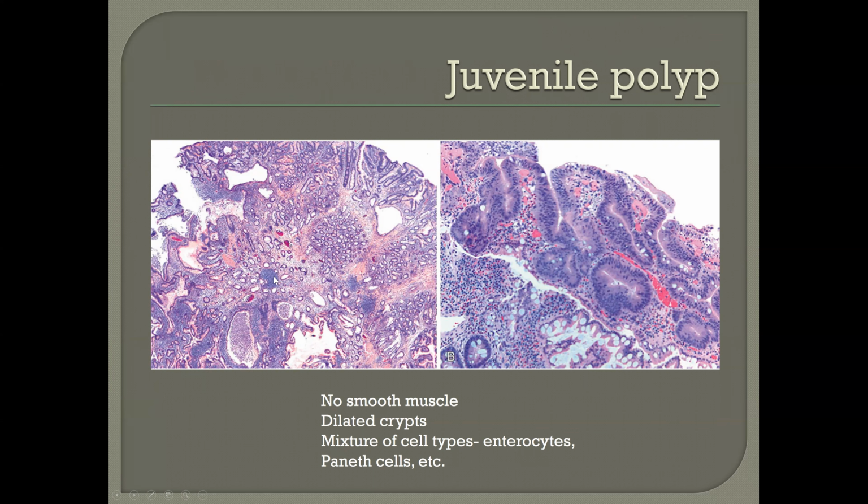The lymphoid component here is kind of hit or miss. Sometimes you will have that, sometimes not. And as we mentioned, be sure to look for areas of potential dysplasia in these lesions, manifest as you would see dysplasia elsewhere.